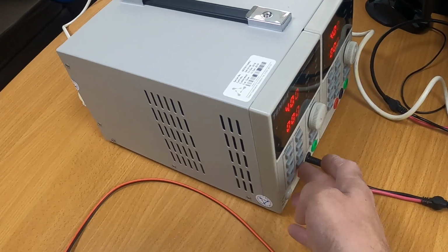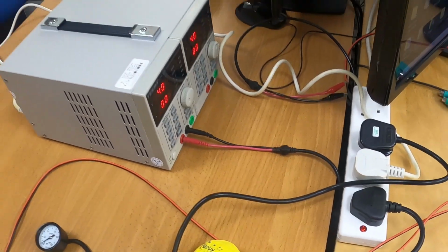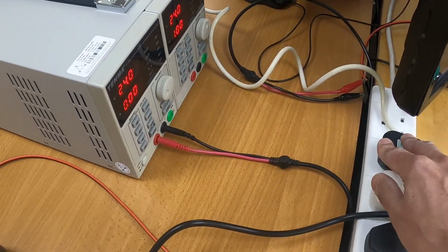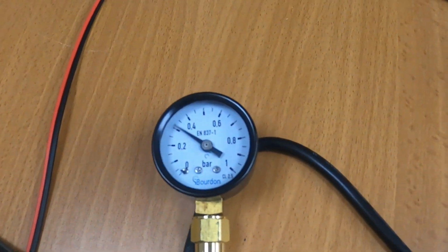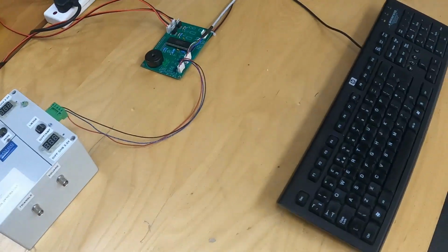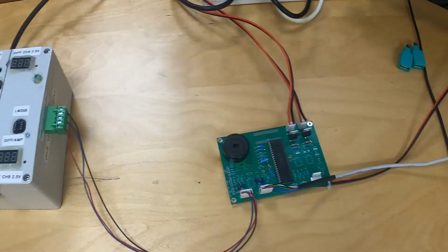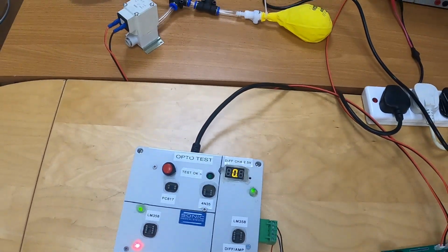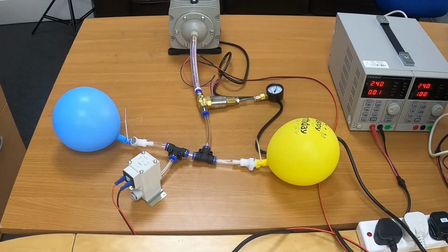Switch that on. Send 24 volts to the solenoids. Plug in the pump. As you can see, we have pressure. Right, I've already sent that demo program to this. So let's switch on. With the buzz. Oh, there goes the lungs.